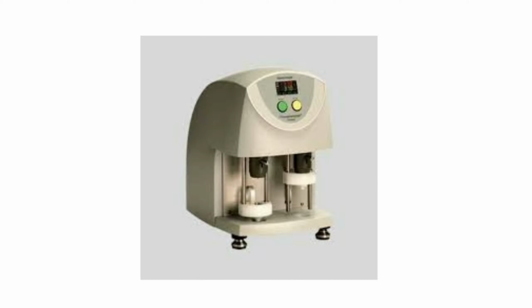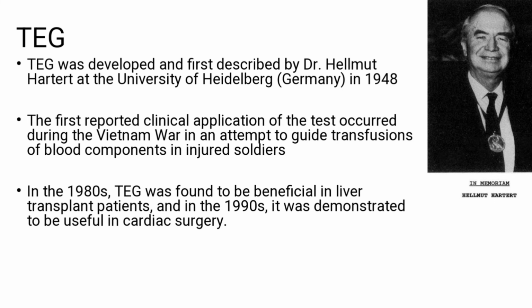Today we are going to discuss thromboelastography. Recently in NEET PG and in INICET, both exams, this topic has been asked. So I thought we should discuss this. Basically, this is the machine known as the thromboelastograph, and as you can see, this machine has two chambers, one here and another here. We'll know in detail about this in the subsequent slides.